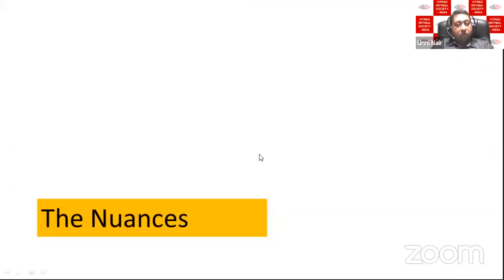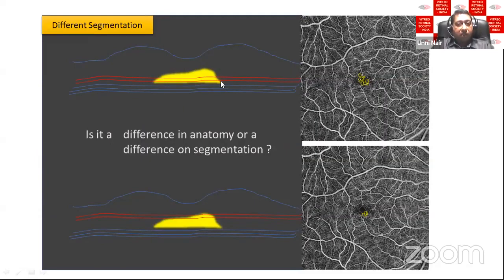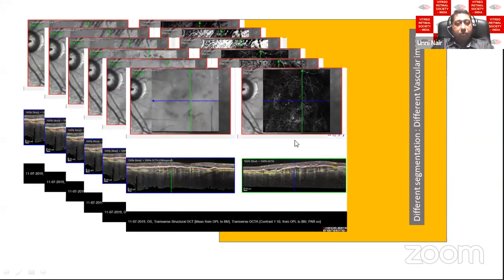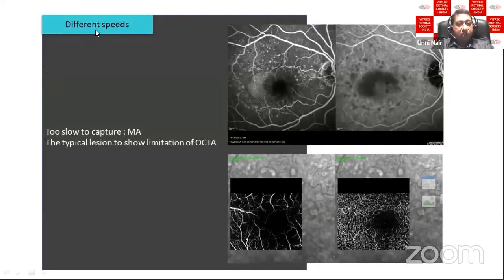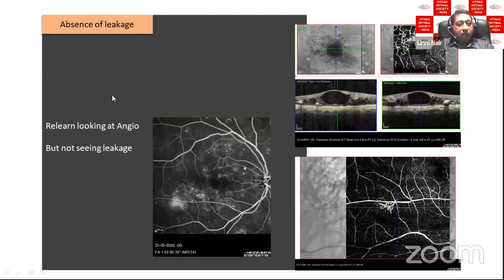Regarding nuances of OCTA recognition: any lesion's appearance depends entirely on where the segmentation is taken — it can look bigger or smaller. Different sections of a CNVM produce different images and sizes, potentially causing confusion about lesion size. Different speeds affect detection: the OCTA can only pick up a particular velocity threshold of RBCs. Microaneurysms are typical lesions demonstrating OCTA limitations — visible on fluorescein angiography but not seen on corresponding OCT angiography.